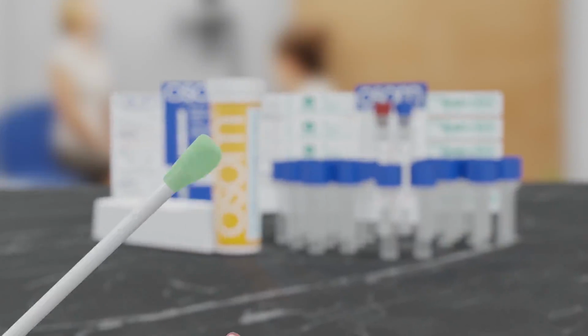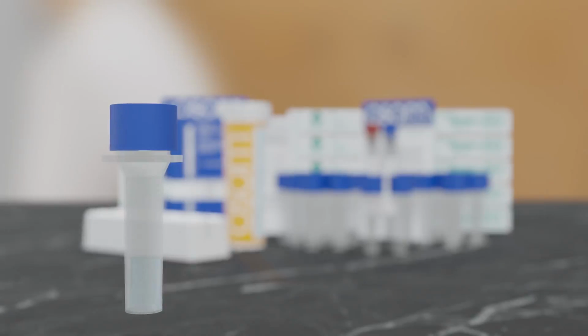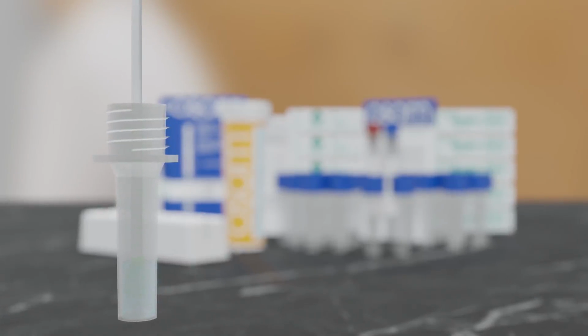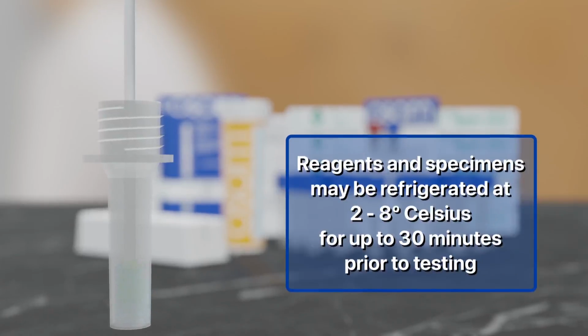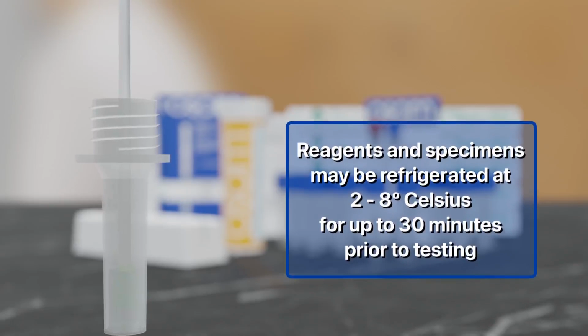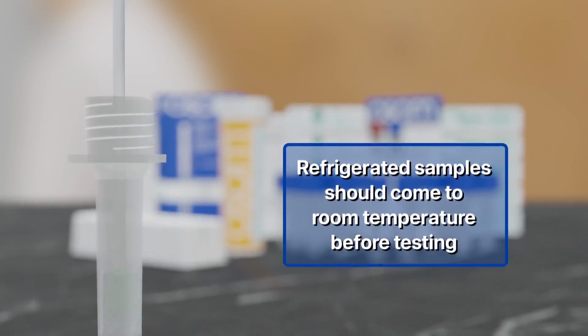The following procedures are recommended for proper sample collection and preparation. To obtain accurate results, do not use visually bloody or overly viscous samples. Freshly collected patient samples should be processed in the extraction buffer vial as soon as possible after collection. If the sample cannot be processed immediately, the patient swab may be stored at room temperature, 15 to 30 degrees Celsius, for up to 30 minutes, or refrigerated, 2 to 8 degrees Celsius, for up to 30 minutes prior to testing in a clean, dry container. Refrigerated samples should come to room temperature before testing.